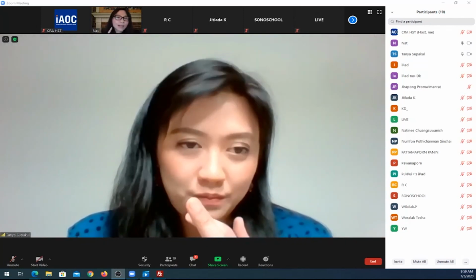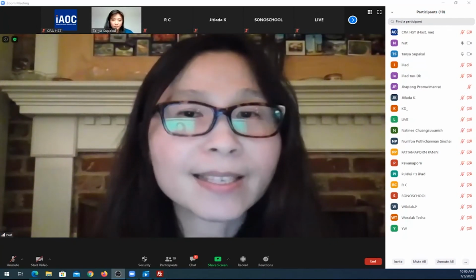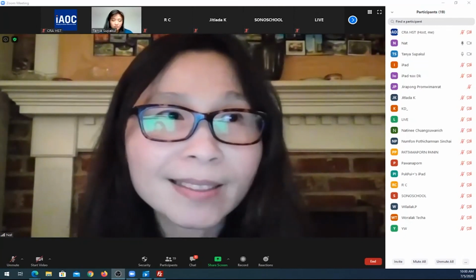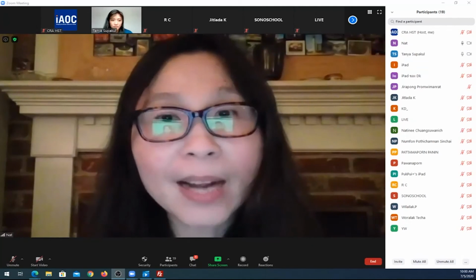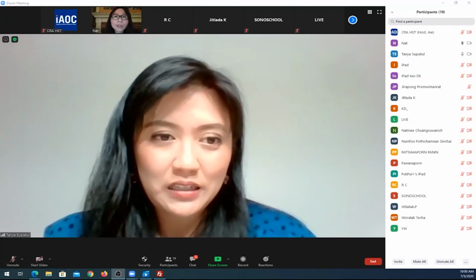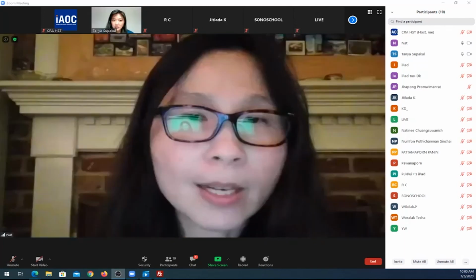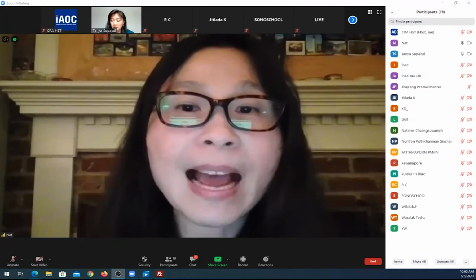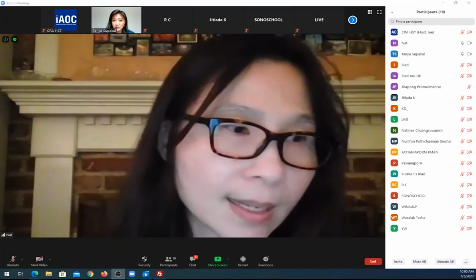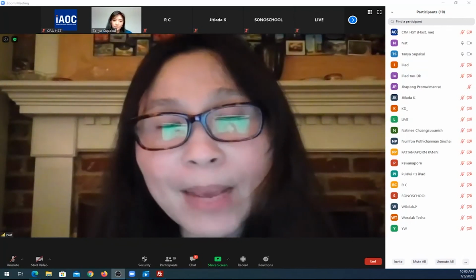Okay, for PE, the answer is no gating. But for aortic dissection, if you ask the clinician which part of the aorta, ascending or descending, they will say, I don't know. In that case, I think it's worth doing prospective gating because the dose is not a lot. If they really have no idea what they are looking for, we will see the aortic root very clearly, so we can rule out type A dissection.